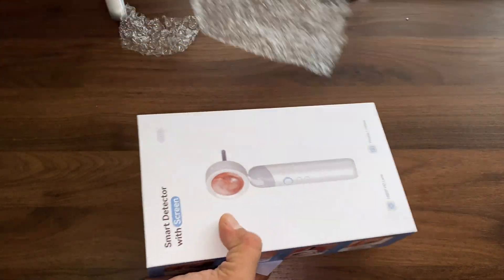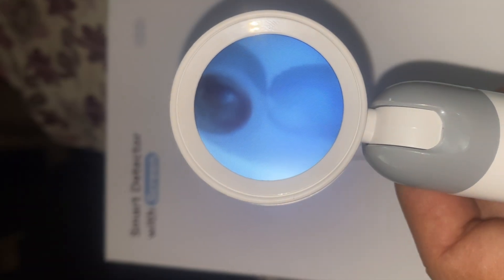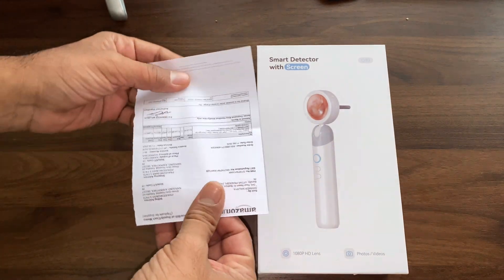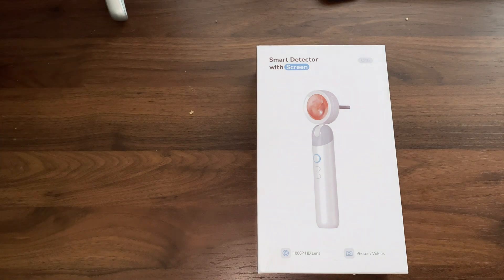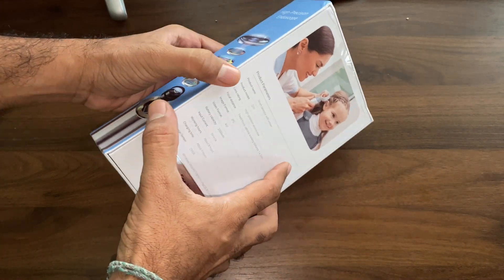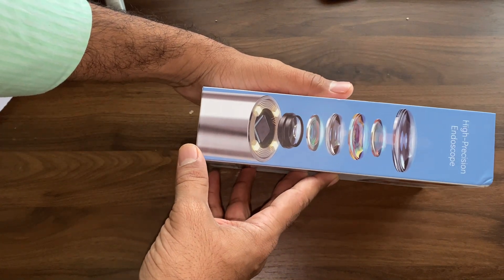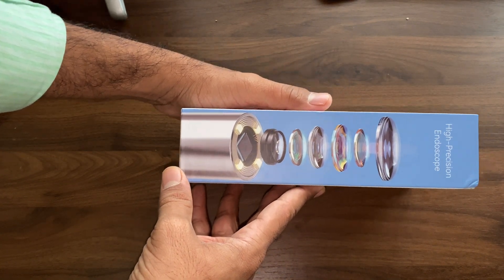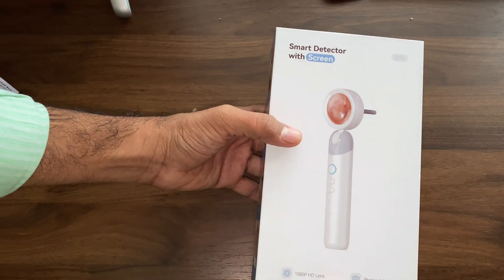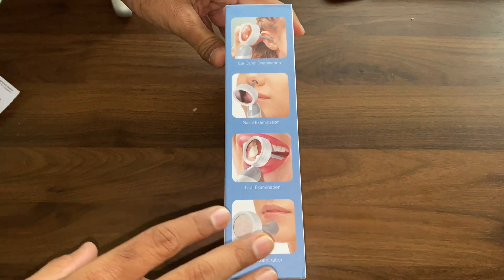It has an LCD screen — specifically a 1.38 inch HD IPS display with a PPI of 246. It also has multiple lenses at the tip by which we can zoom to 1x, 2x, 3x, and up to 4x.